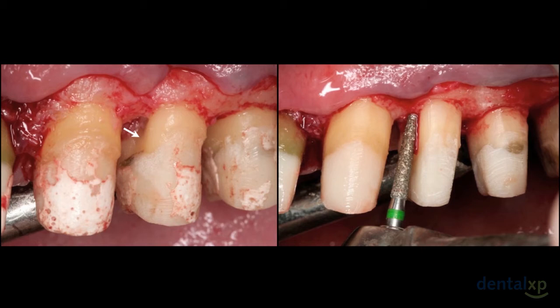The burr tip is to be placed just where the bone and tooth surface meet and gently moved around the tooth 360 degrees, removing all accretions, all CEJs, and creating a perfectly smooth tooth surface for further treatment. More importantly, the interface between the bone and tooth surface is perfect. There are no more defects, and it allows for the tissue to lay over the bone in a harmonious fashion.